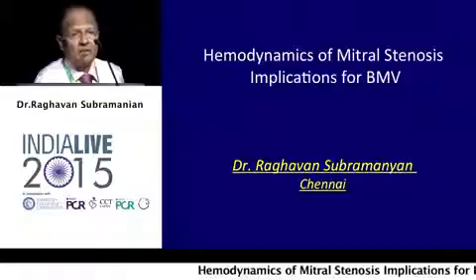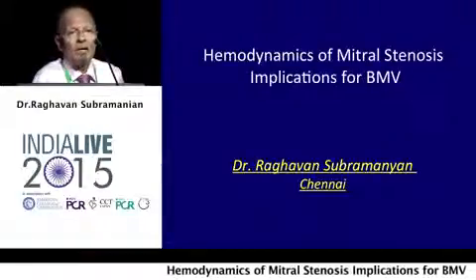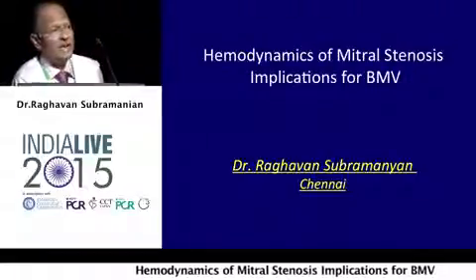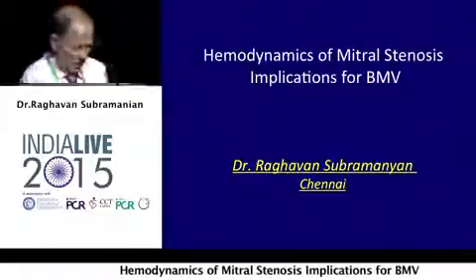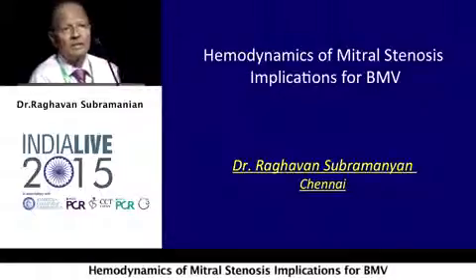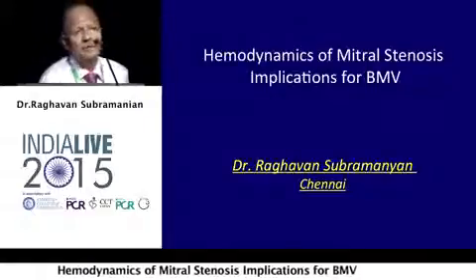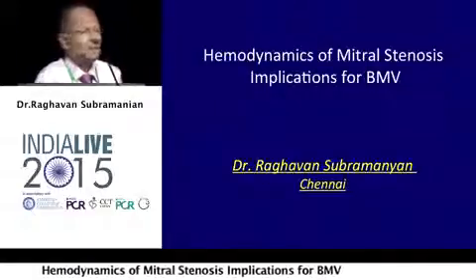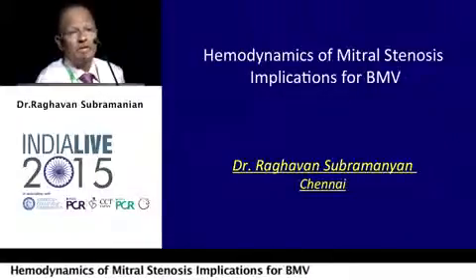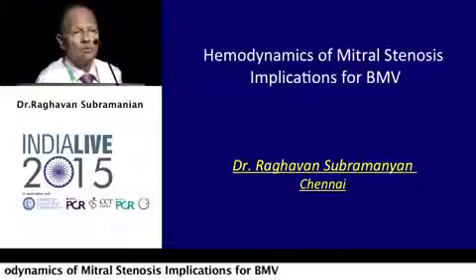But for the vast majority of people, and for many patients, accurate determination of hemodynamics becomes essential, not only to decide the need for balloon mitral valvotomy, but also to know when not to do it, and finally to recognize some complications and fallacies. So in the next 10 or 15 minutes, I'm going to show you a series of real-life examples which should convince you that accurate measurement of hemodynamics still has a useful role in doing balloon mitral valvotomy.